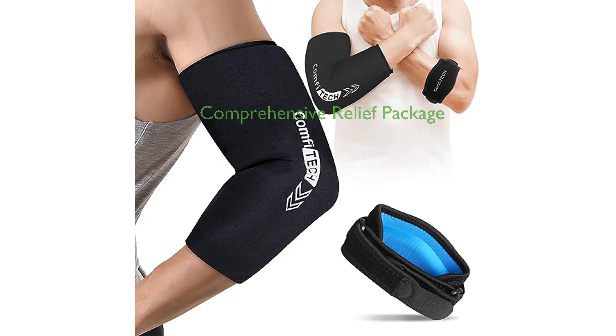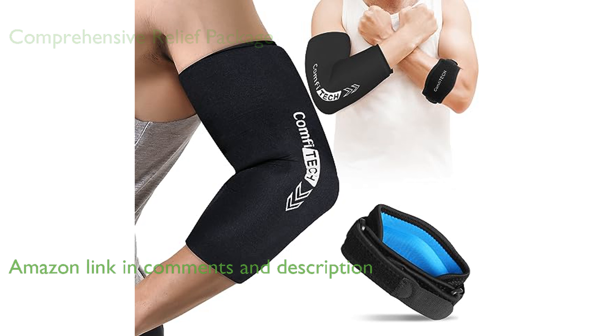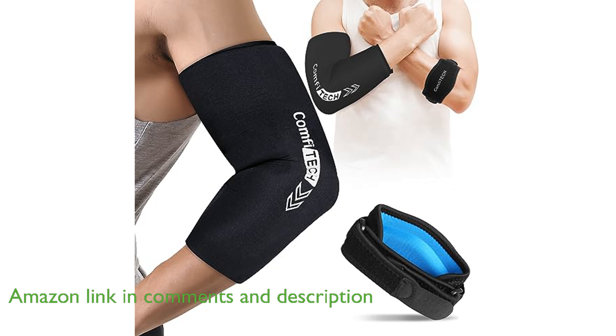The Comfitec Tennis Elbow Brace Combo is a comprehensive package designed to provide relief for conditions such as tennis or golf elbow, tendonitis, sprains, arthritis, joint discomfort, inflammation, and sports injuries.